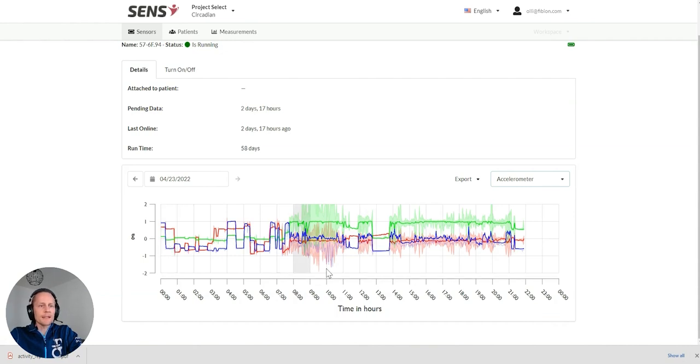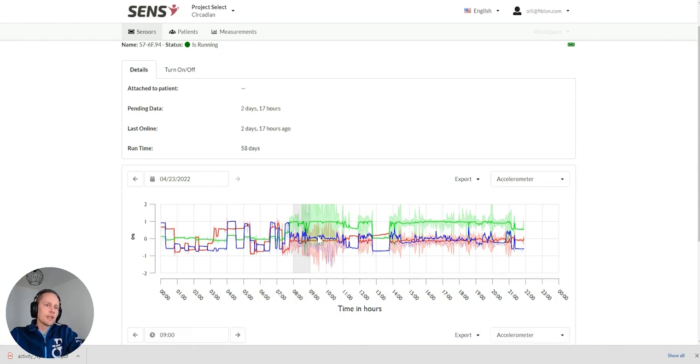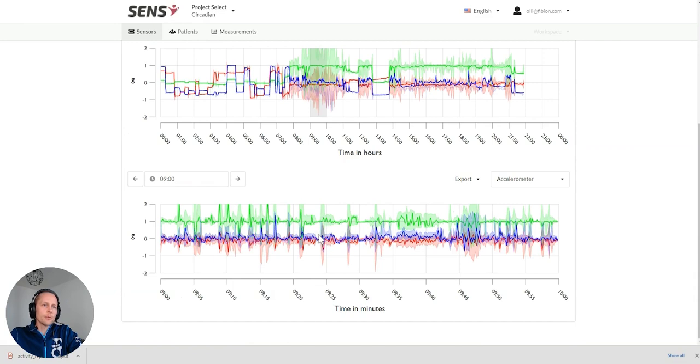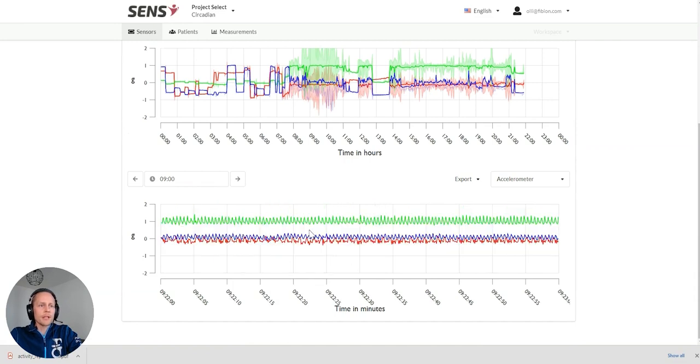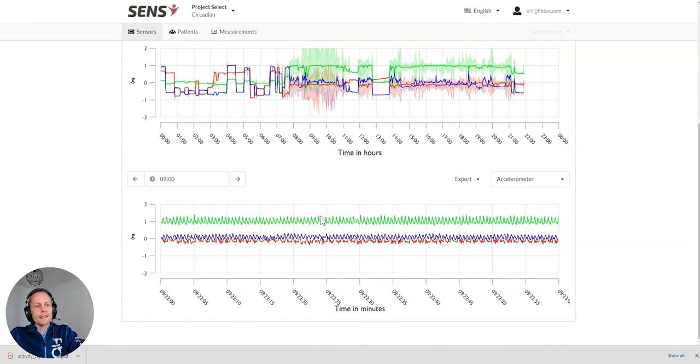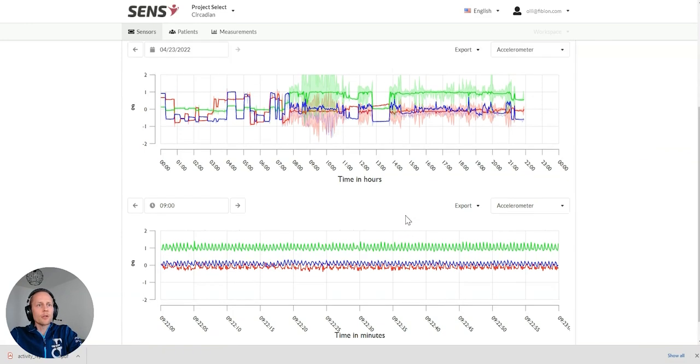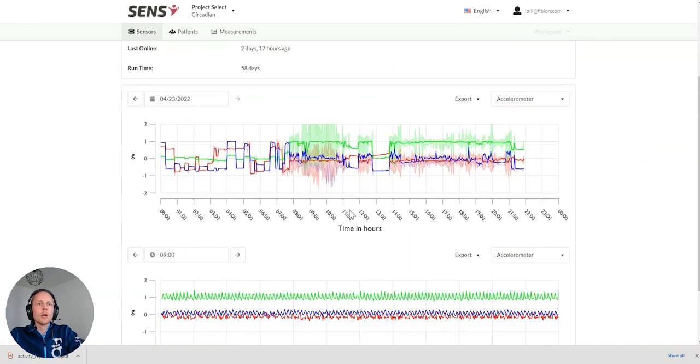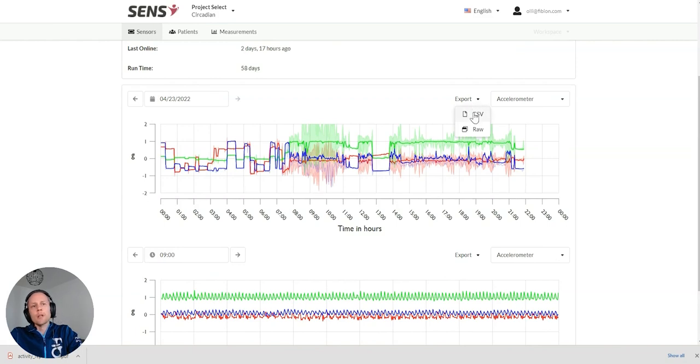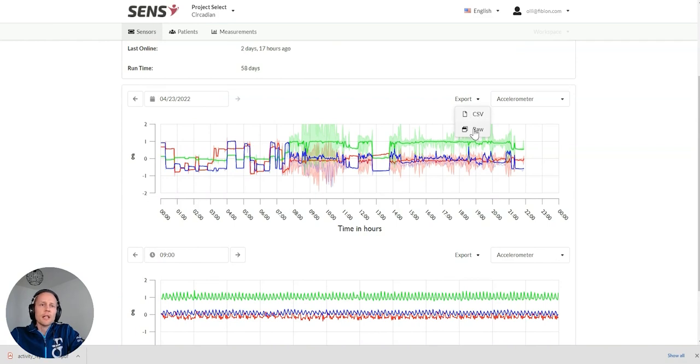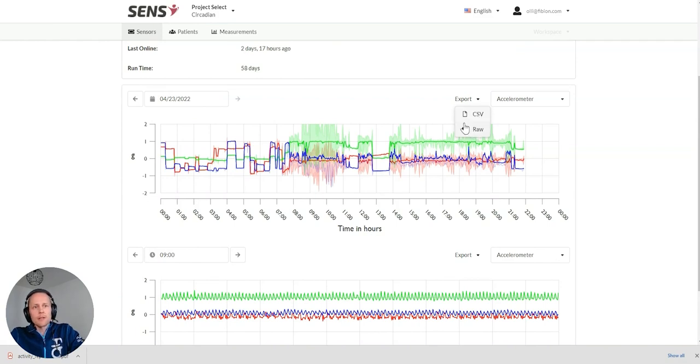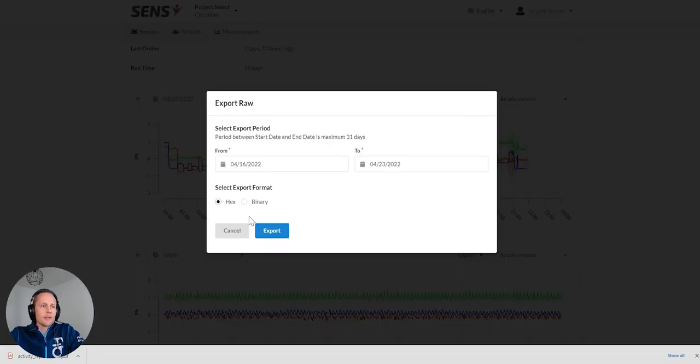You can also zoom in to certain part of the data. You can zoom in and see each step there when the person has been walking. And if you want to export this, you can export the raw data as a CSV file or raw data in different file formats.